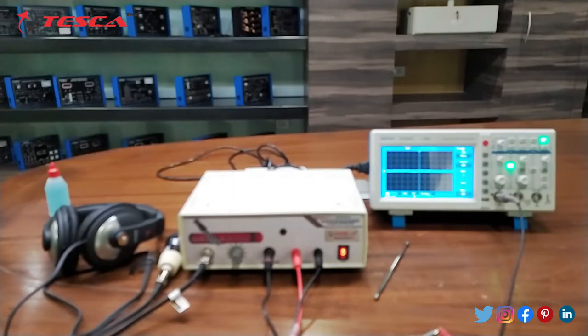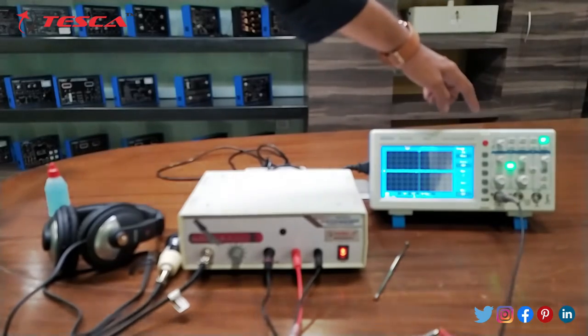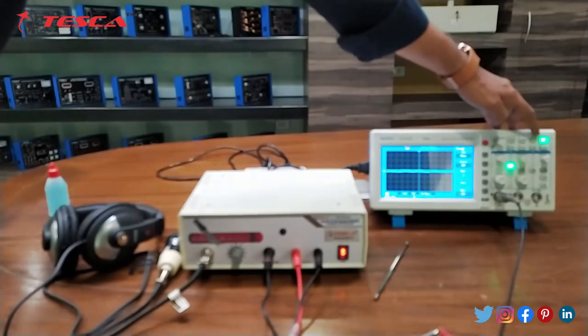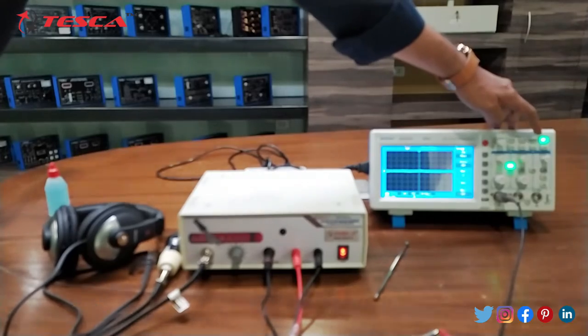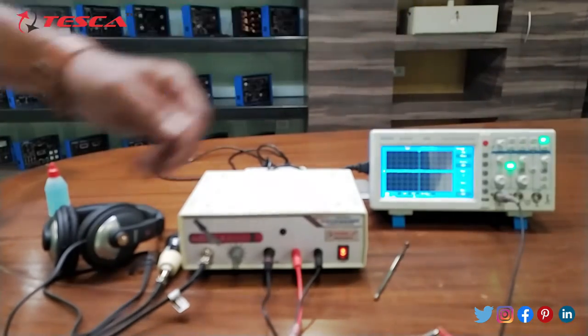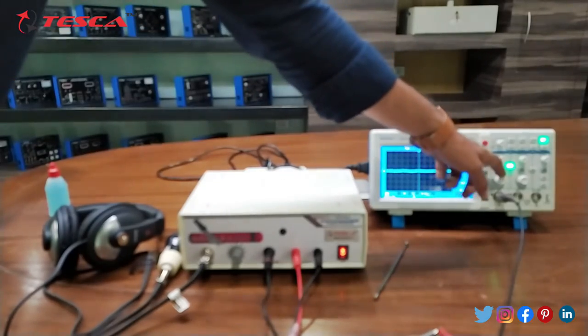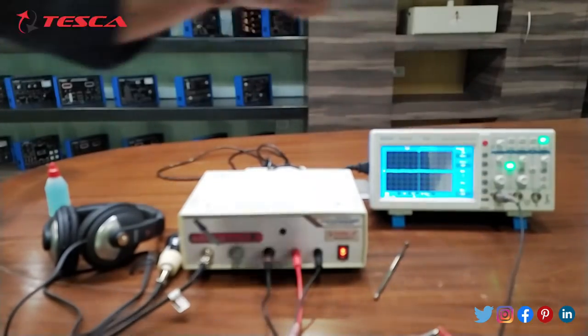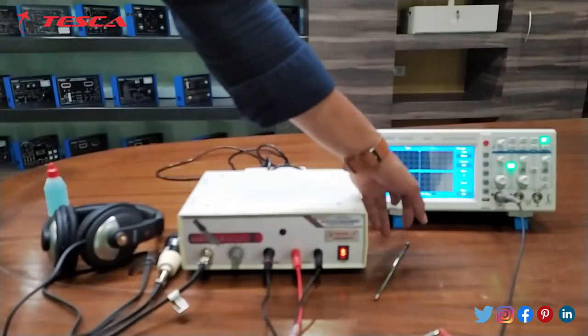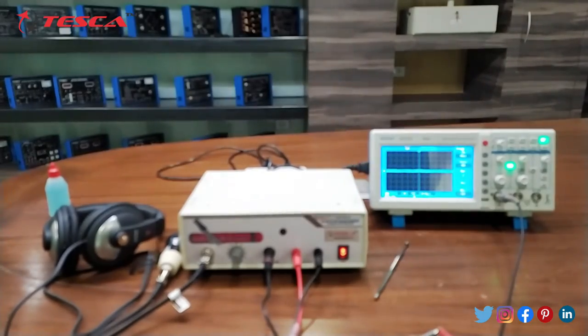Some of the points you should keep in mind while performing this experiment: You should keep the DSO on storage mode. And here is the storage button. You should press it before starting the experiment. Then you should keep the voltage at 0.5V. From here you can control the voltage and you will see the voltage here. These are the points you should keep in mind.